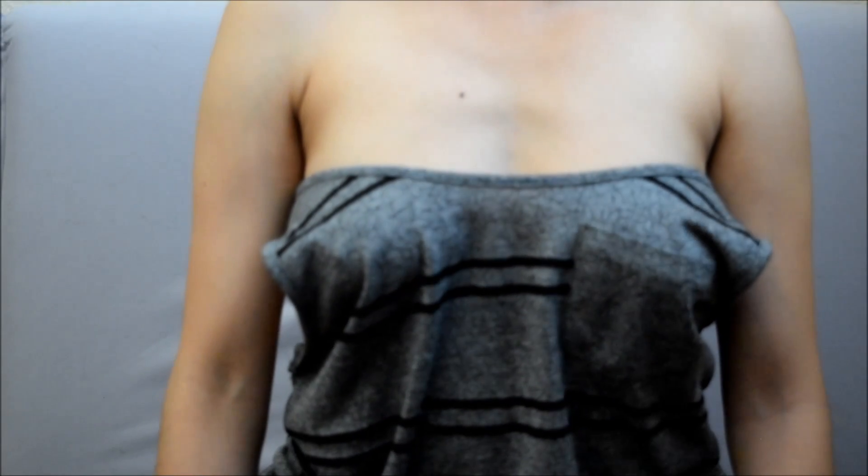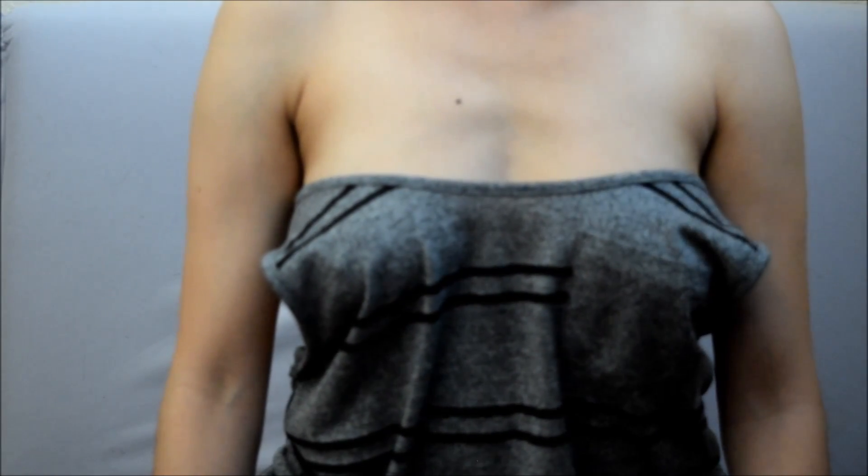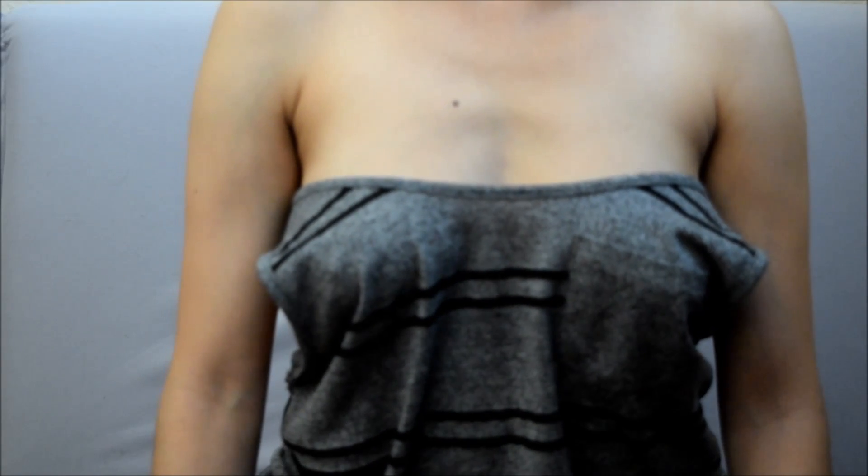This is a basic tutorial on how to listen to the different points of the heart sounds. We're going to listen to the apical pulse for a minute.